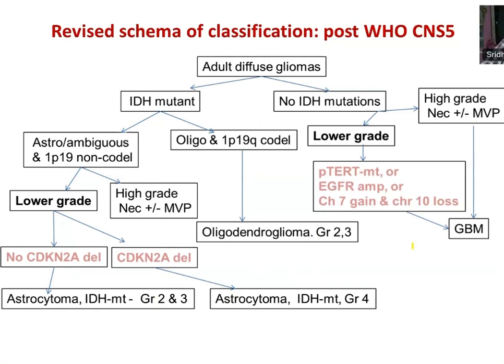Did you listen to the question, Shreya, Anita, and Abhirami? Please repeat. Can you repeat the question, Pooja? They did not hear it. If IDH1 R132 is negative, also negative by molecular studies, and ATRX is also lost, then what do we call it?